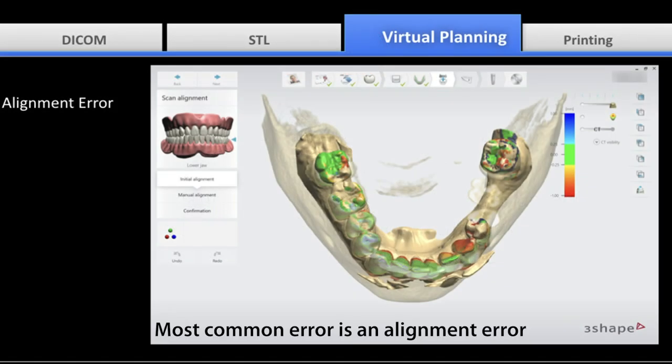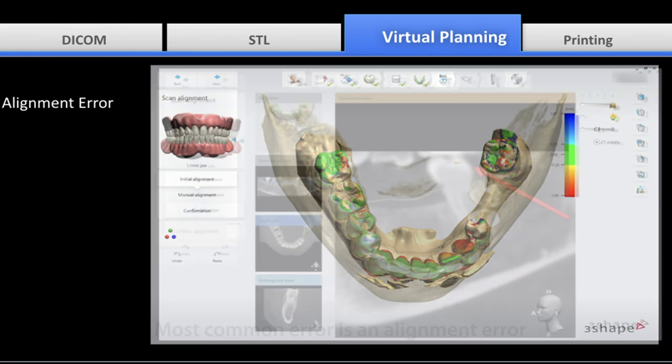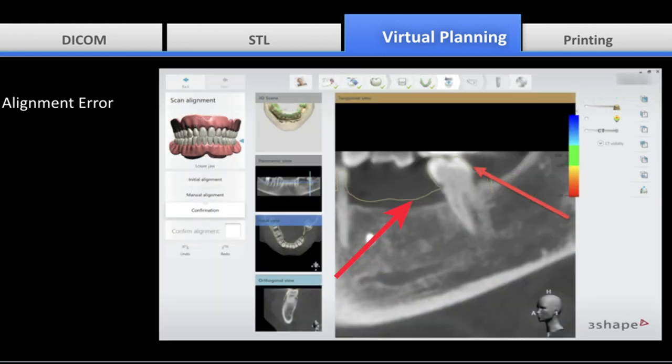During implant planning, there are different sources of error. The most common source of error is alignment error. As you can see, the yellow line representing the study model is not following the radiopaque surface of the corresponding dental structures. Alignment is adjusted to have a complete and accurate overlap, or accurate stitch, between the two surfaces.